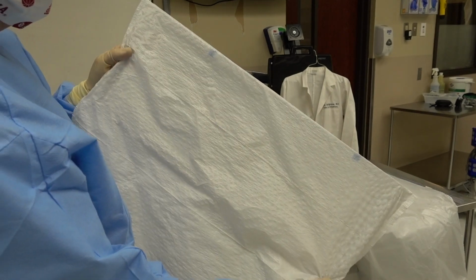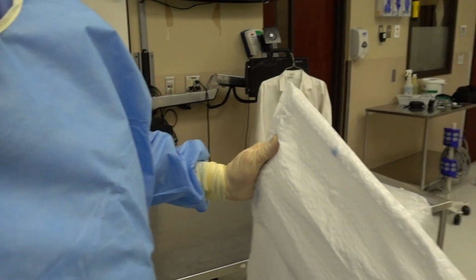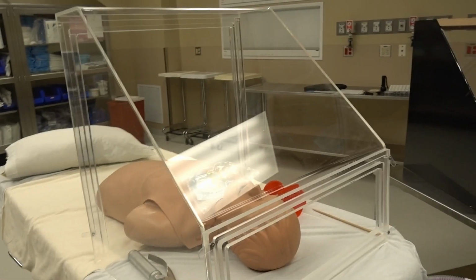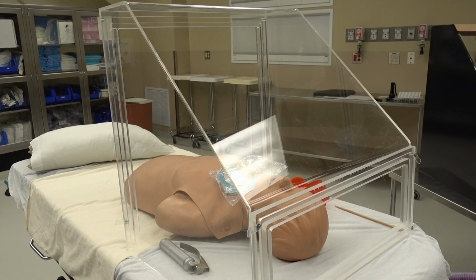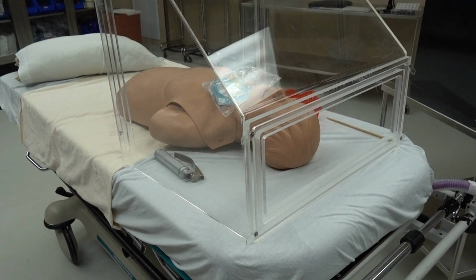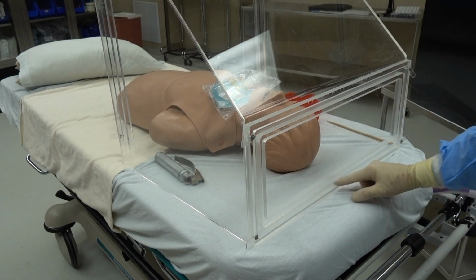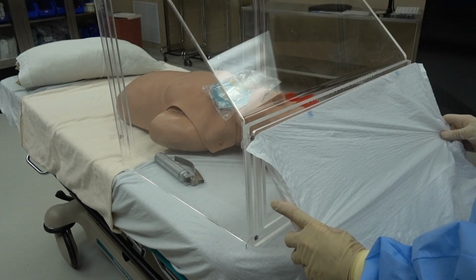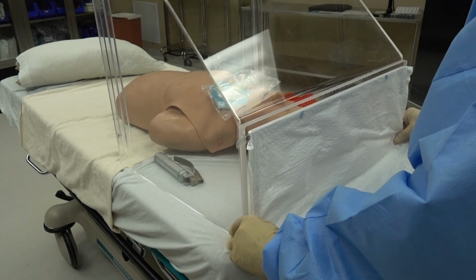But you see how easy it slides into the bag. And so you just take it over here to the chamber, and they could bring these preloaded, all the bags already in place. So there's a mitered router opening right here, and this is going to fit in there. So you put it to the end of it, line it up, and you just place it in the chamber.